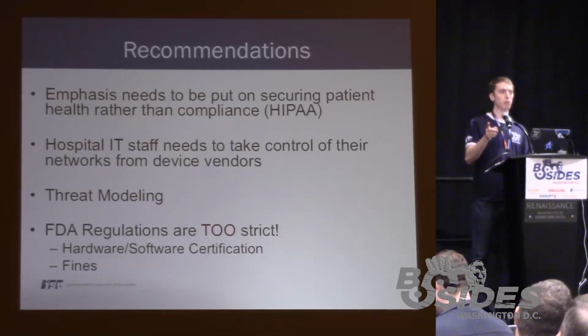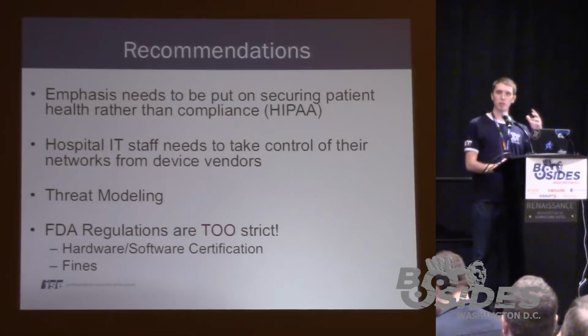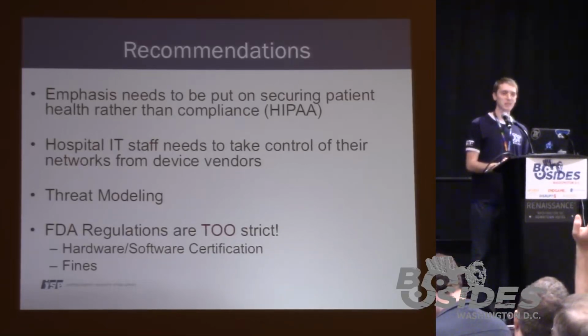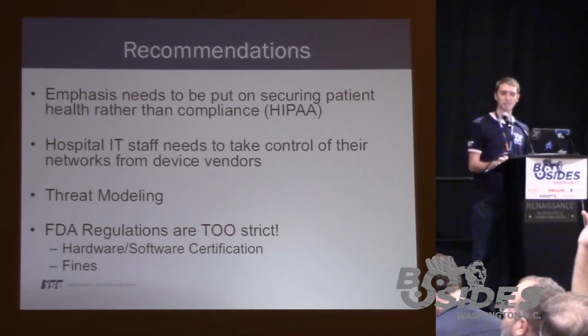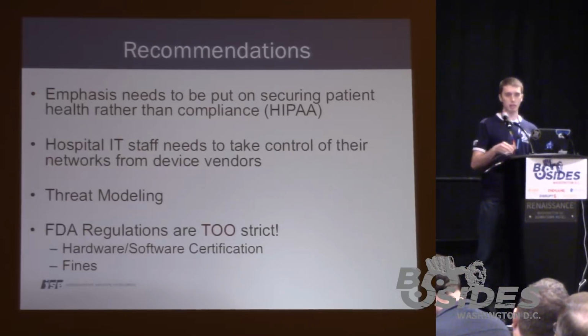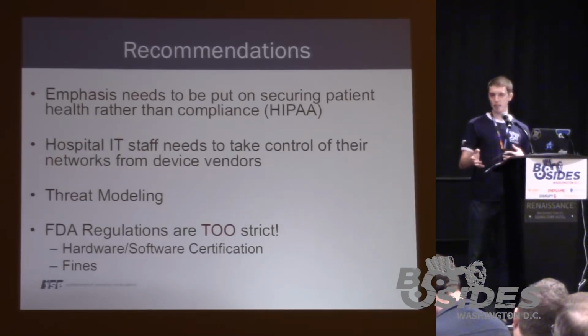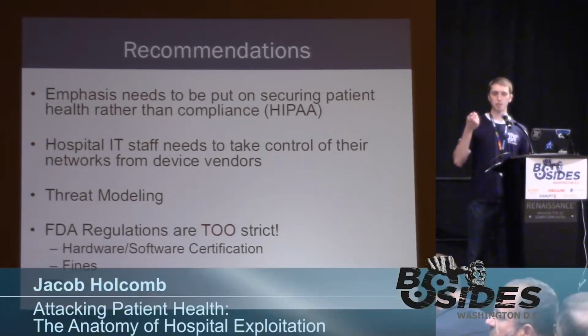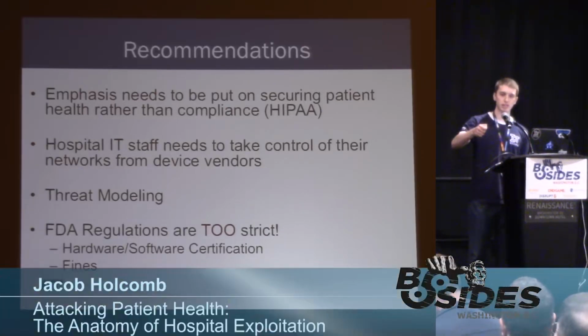Yeah, I knew it was a multi-month process. I thought it was closer to a 6-month window, but you said 4 to 12. Wow. Could they go a long way by doing proper network segmentation? So in a lot of cases, network segmentation would reduce the impact of an attack, right? It doesn't make you invulnerable. You can make a lot of these systems inaccessible to an attacker. But again, all it would take is somebody to plug a flash drive into a network segment that has a vulnerable device, and from there it's game over.